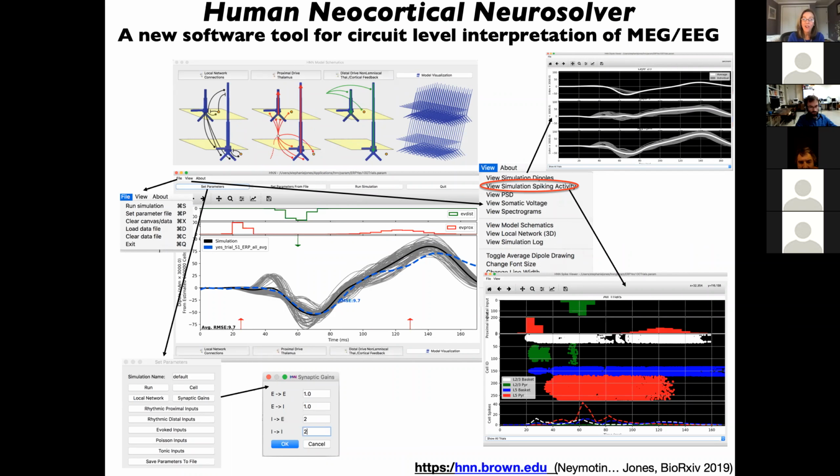I see. Because the impression I got. Yeah, sorry, go ahead. We're working to make it so that it works on any signal. Ultimately, I'm realizing what the community wants is to put in a waveform and have the software tell them how it is created in the neurons. Now, I originally thought that's impossible, that doesn't make any sense, but now I'm rethinking things because there really are only so many signals you get out of the head, right? You get ERPs, you get low frequency oscillations.